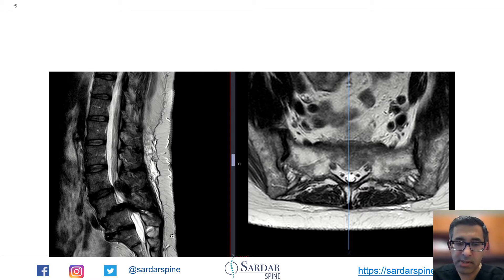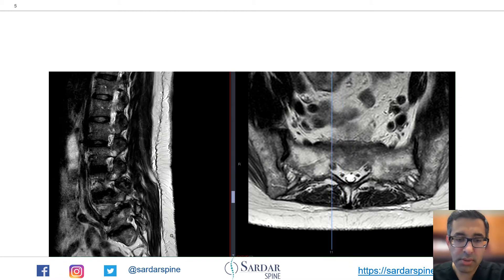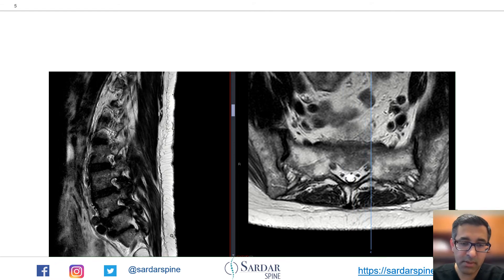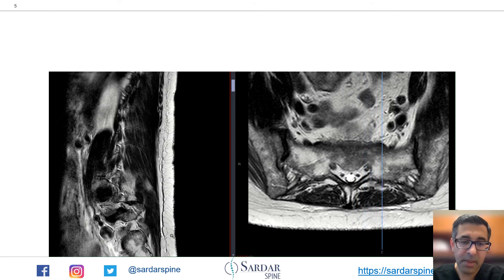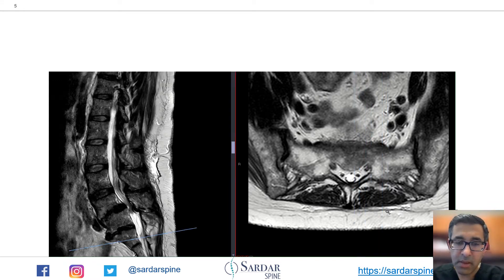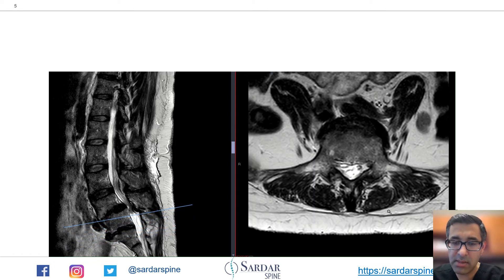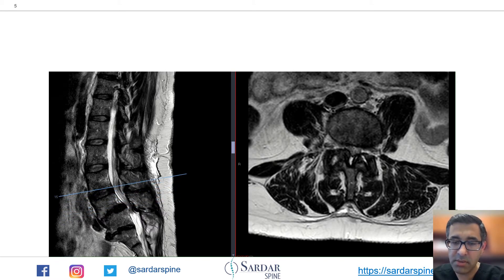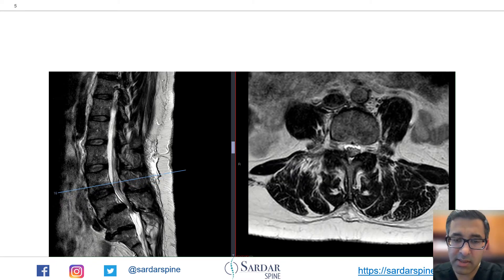Here's an MRI slice showing quite significant foraminal stenosis bilaterally from L4 to S1. On the sagittals you can see there's a lot of disc degeneration at L4-L5 and L5-S1. On the axials you can see significant facet arthrosis and severe spinal stenosis at L4-L5, and also moderate stenosis at L3-L4.